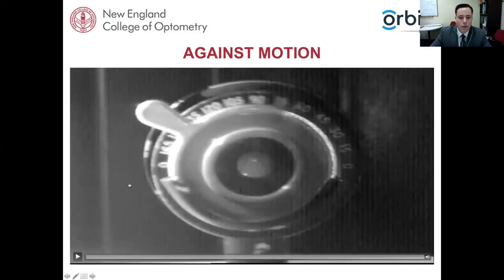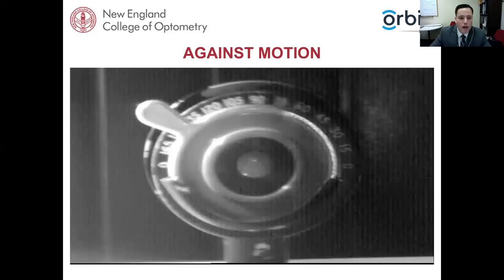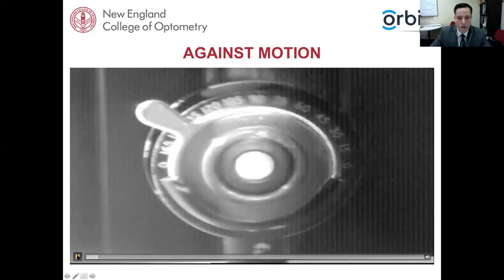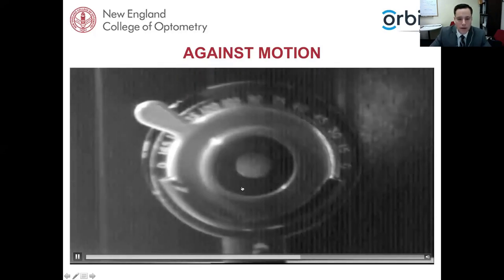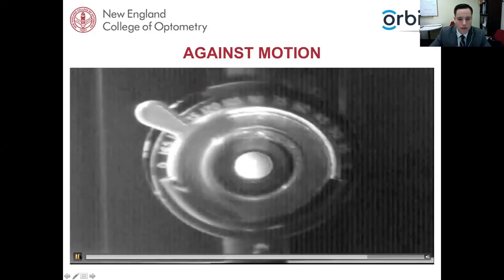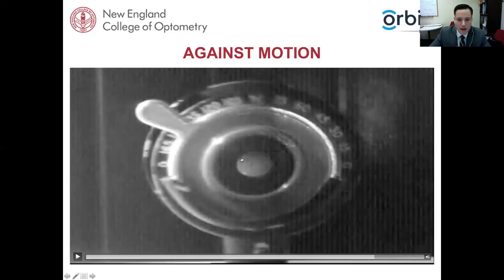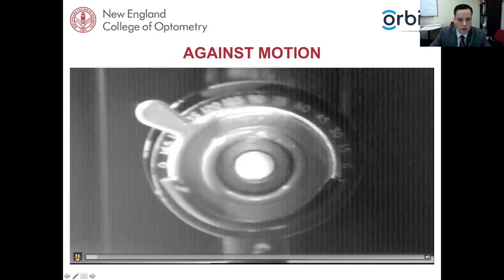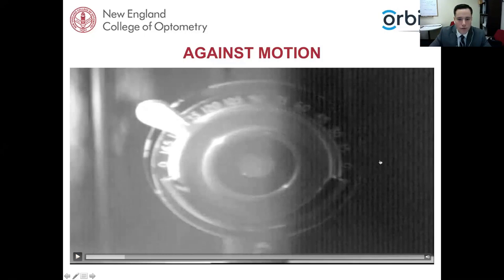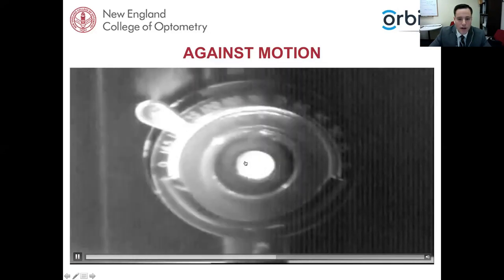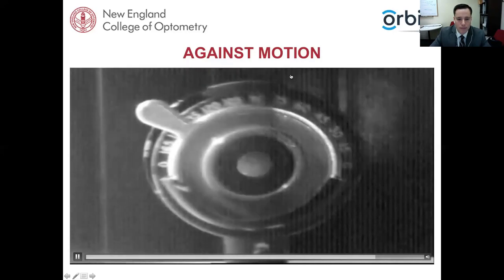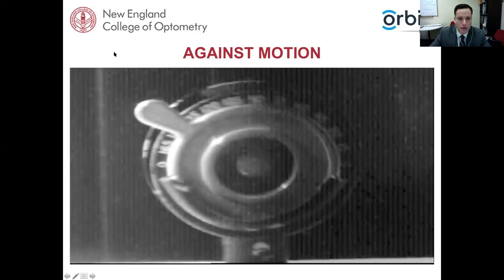Here's a video example of what against motion looks like. As they scope to the right, the reflex moves left; as they scope to the left, the reflex moves right. The reflex in the pupil and the scope of light outside are going in opposite directions — that's against motion. This is a really good example of against motion.